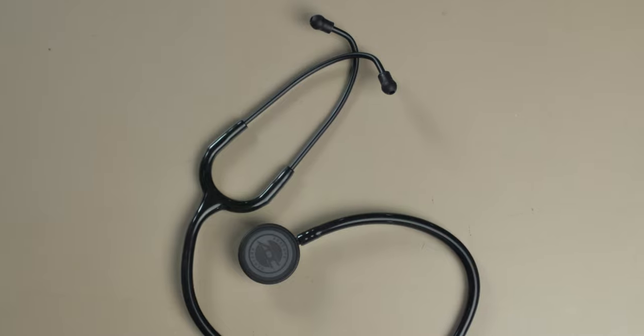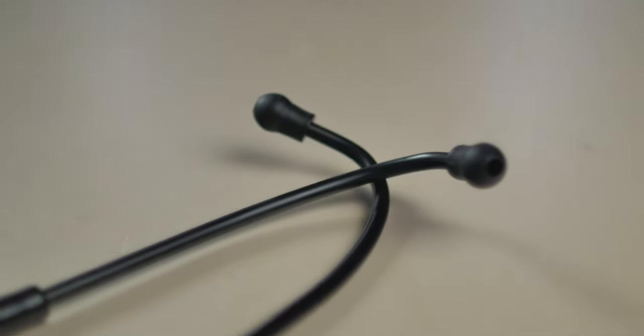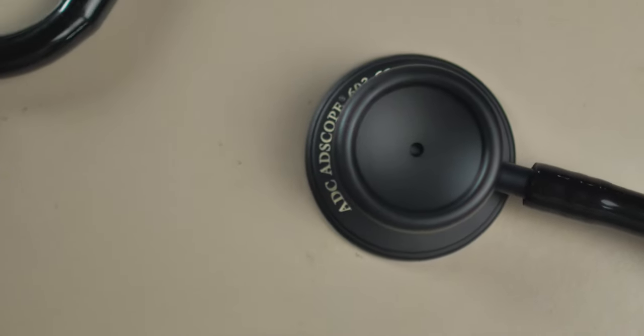Next up is the ADC Adscope 603. This is made by ADC — parts made outside the US but assembled here. I like this versus a Littmann, which is made by 3M and is one of the most popular stethoscopes out there. The ADC is a good bit cheaper than a Littmann for what I believe to be the same quality sound — you're paying for the name brand with Littmann. ADC also has lifetime warranties and will send you replacement parts. On this Adscope, one side has a diaphragm and the other side has an open bell without a diaphragm, giving you two options for different pitched sounds.